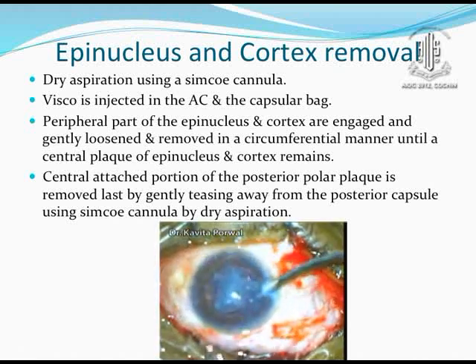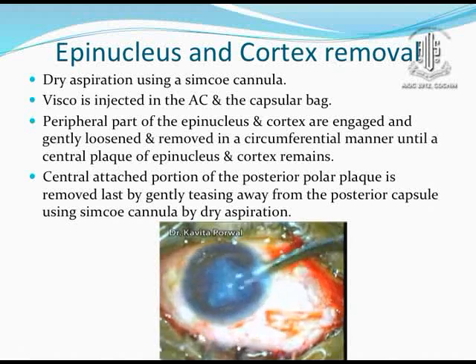See, now almost all 360 degrees of epinucleus and cortex are dislodged from the periphery.